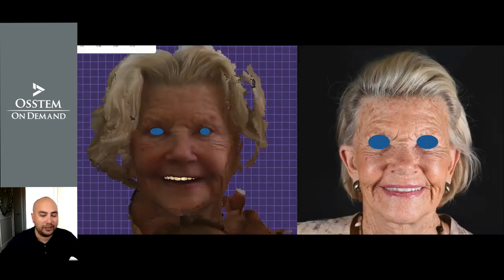And then you can see now how the definitive prosthesis has been adequately designed, right in the midline, right in the middle, and also with adequate display of the dentition.